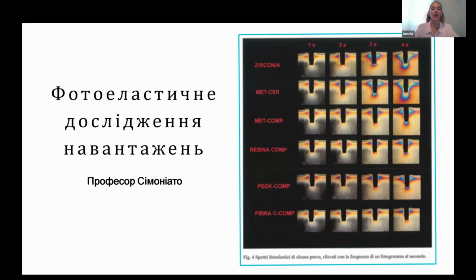We can see how it practically reduces completely the force that is transmitted to the implant. Why? Because we have a material that is resistant but softer and has the capacity to absorb the load it is receiving, to completely disperse the load into the prosthetic and not transfer it to the implant.